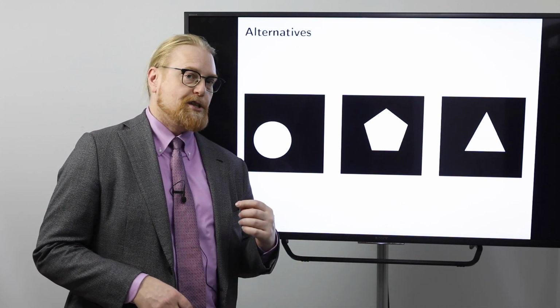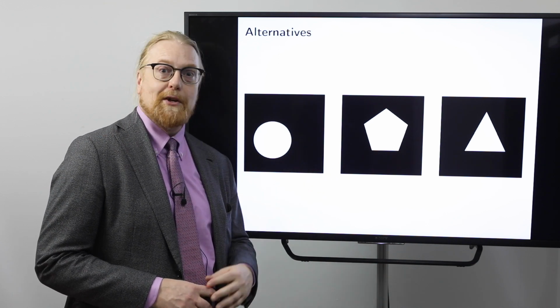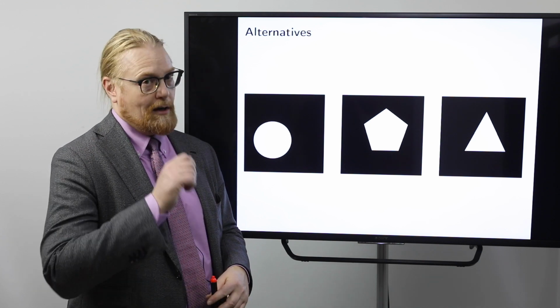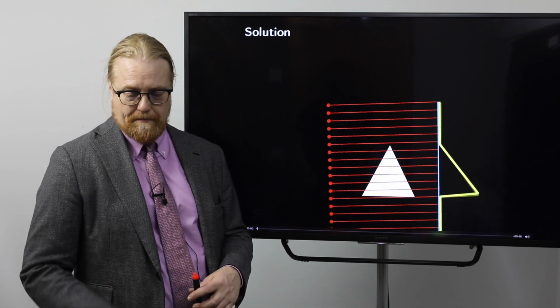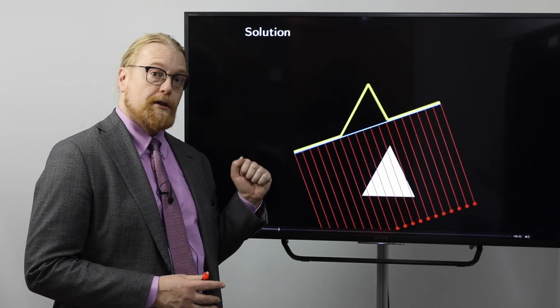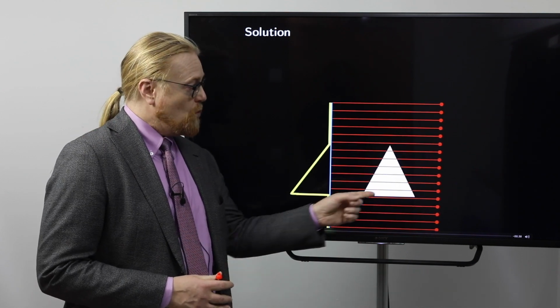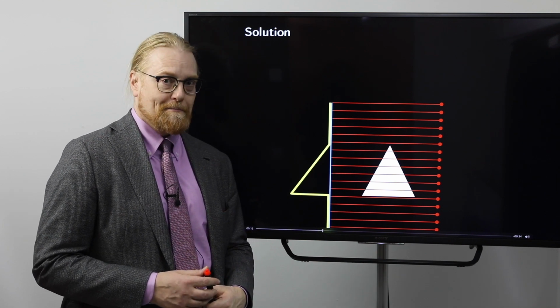You can go back in the video and watch the data again and see if you can figure out which one is the correct one. I will reveal it now. The answer is triangle. As you can see, if you stop the video at any point, you can check that the yellow curve records how long a way the ray traveled inside the white area.